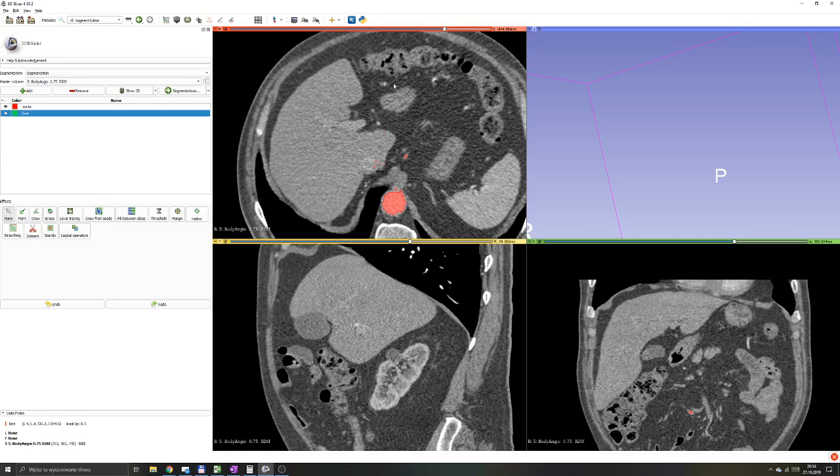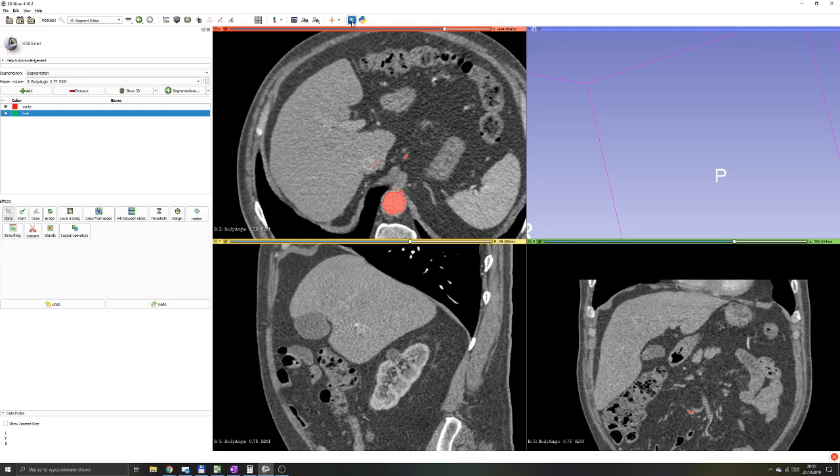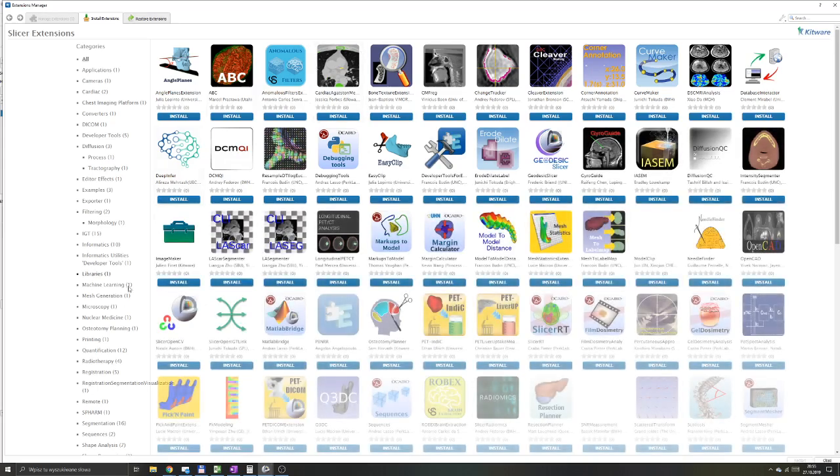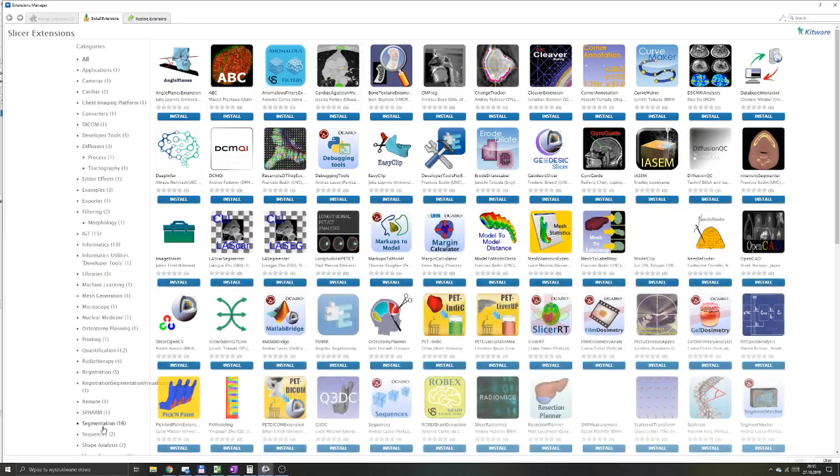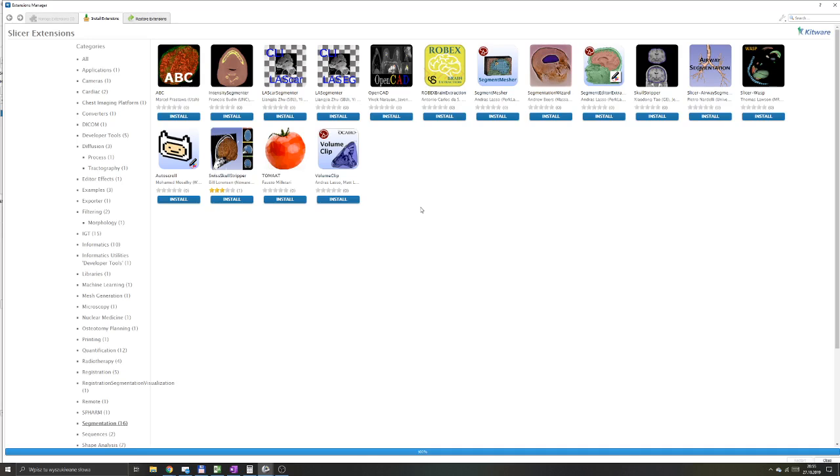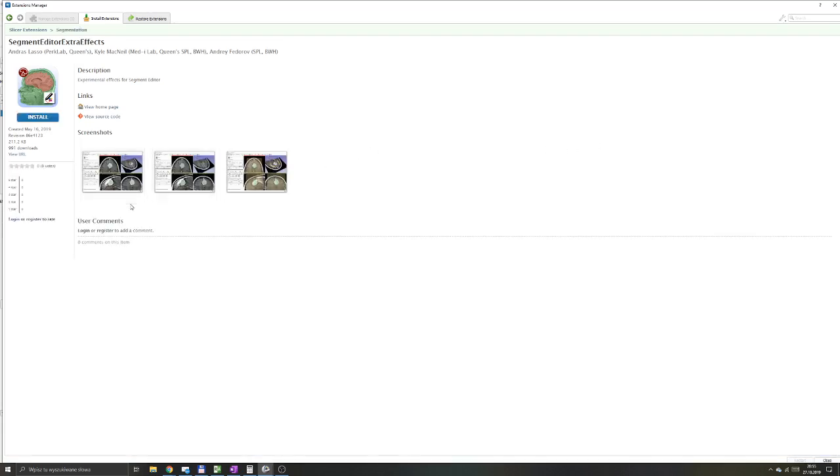However, you might be interested in looking into some external and additional algorithms that might be useful in 3D Slicer. In the top navigation, you will see the second from the right button that will open your extensions manager. In extensions manager, you will find a lot of plugins for 3D Slicer, including segmentation plugins. There are currently 16 available. However, one of them has a lot of new algorithms which is called Segment Editor Extra Effects. You can just install it, and it will automatically update your user interface.